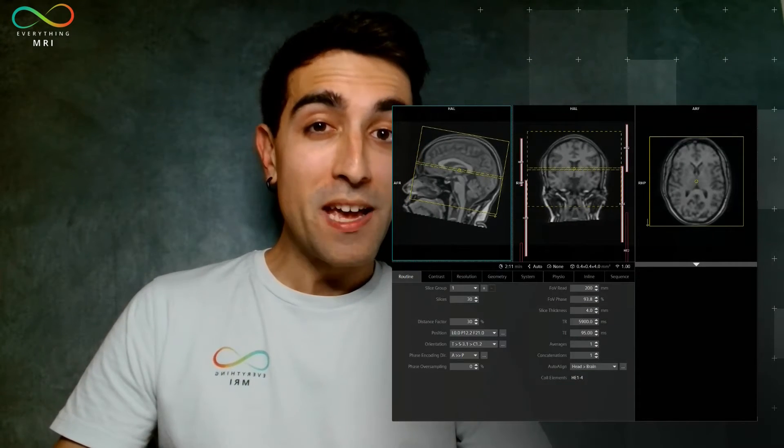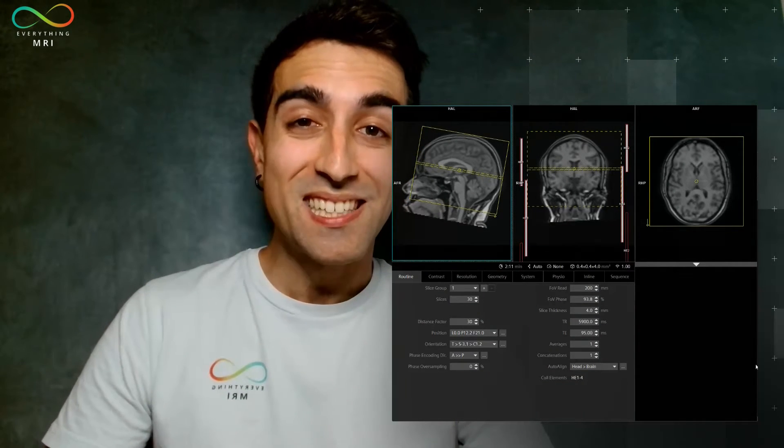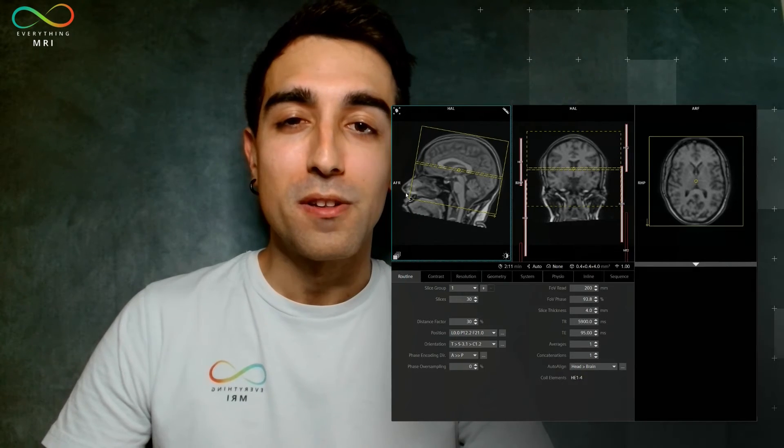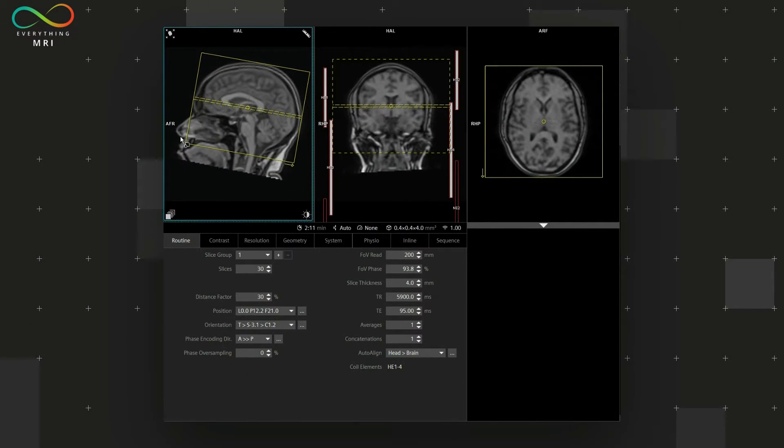Let's showcase now an example on our MR scanner to understand a little bit more the role of this parameter. So there you go, you can see that at the moment in the anterior edge of our FOV in the sagittal plane, we are excluding the nose from the brain anatomy. Now we are actually working with a phase encoding direction that is AP.